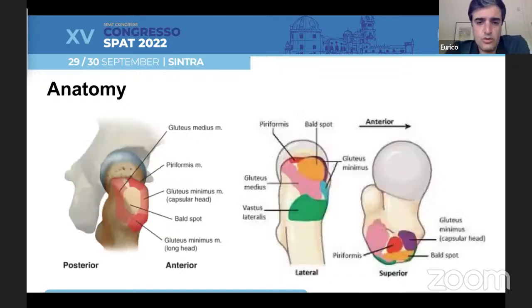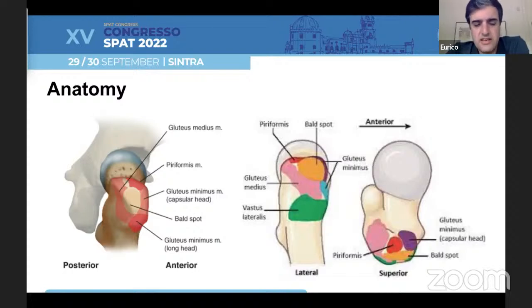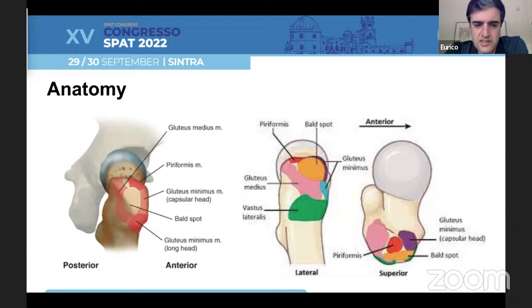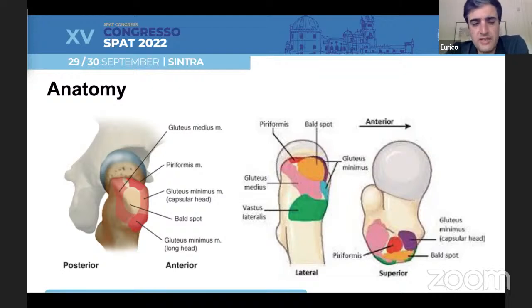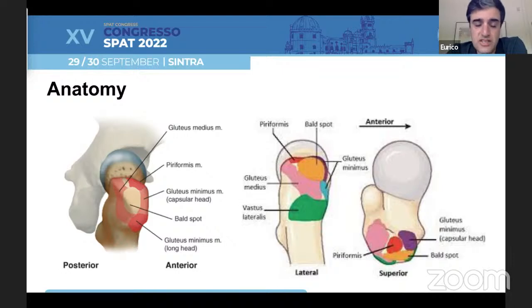When we are checking this anatomy, we know that there is what we call the bald spot. The bald spot has no tendon insertions, so it's the perfect place to put our anchors, without damaging what's left of the tendon insertions. It's also a very good place since, when we are doing our access, we can stick our needle to guide us during the procedure without damaging any muscle or tendinous structures.